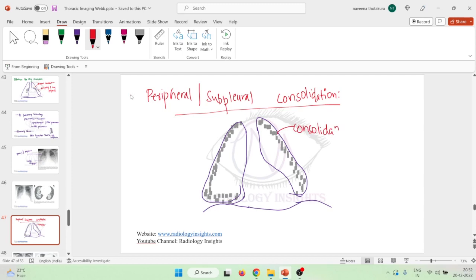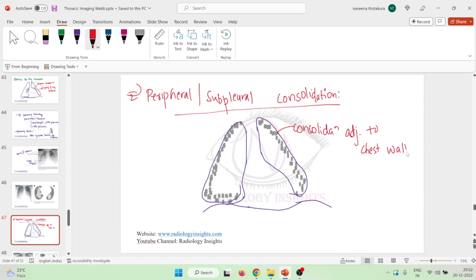The consolidation is present at the peripheries, adjacent to the chest wall, and you will see that there is sparing of the perihilar region.